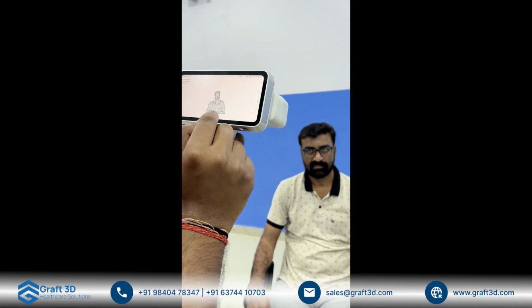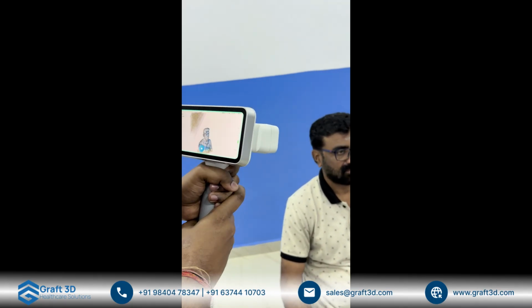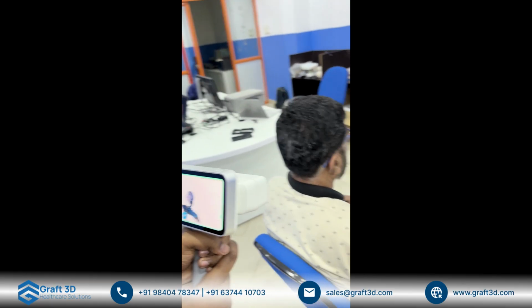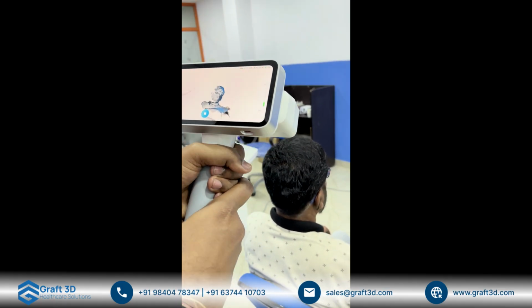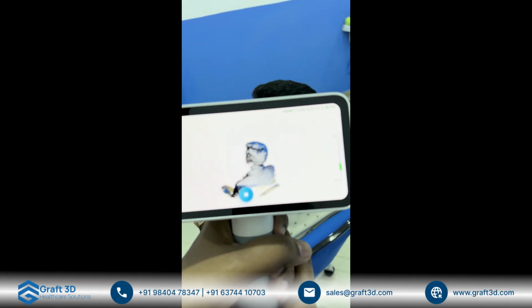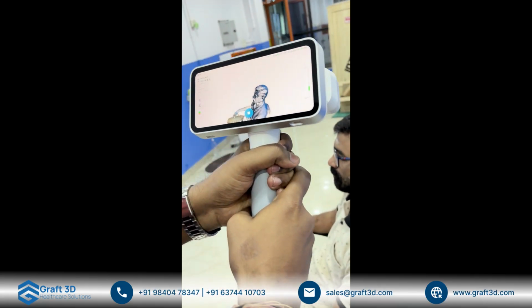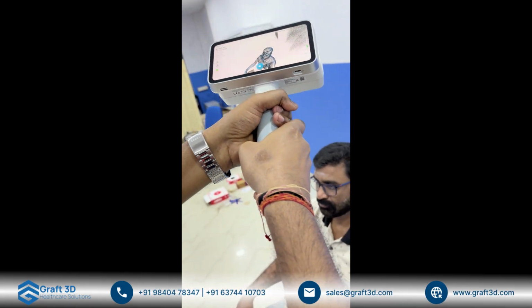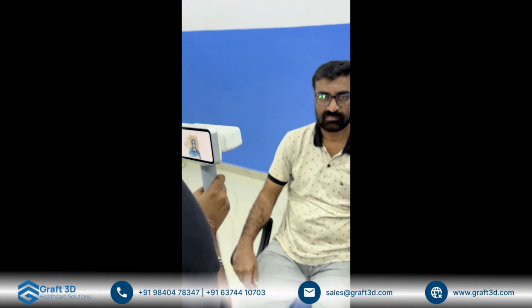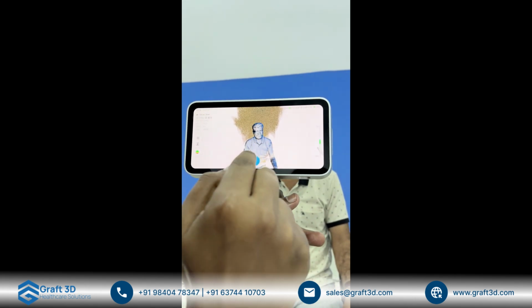We'll start going, we'll say, look. Once I'm done, I'll click on pause.